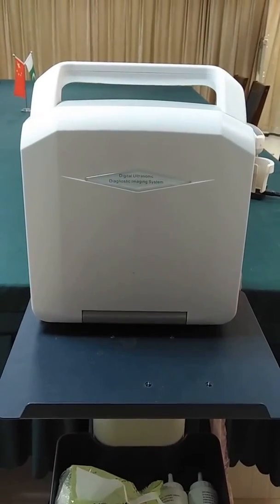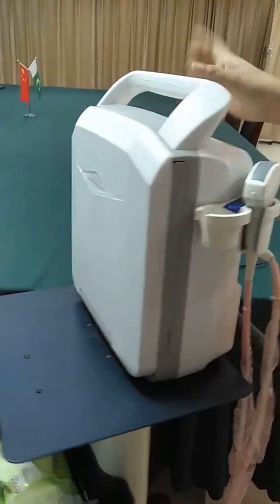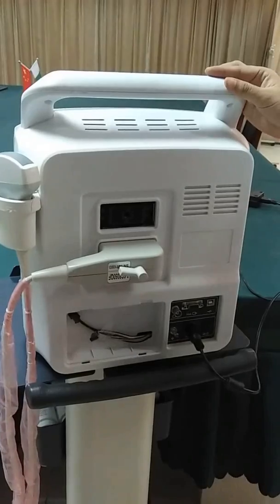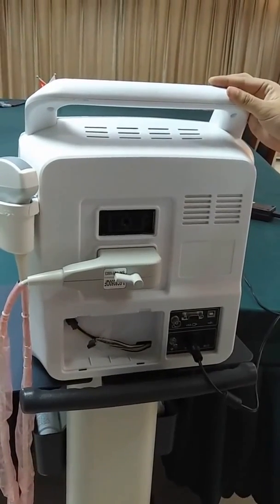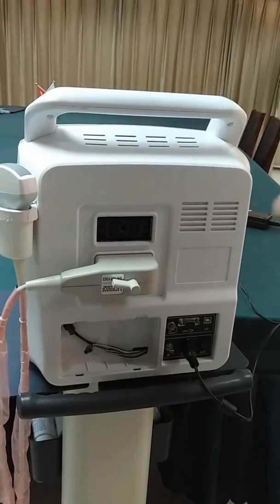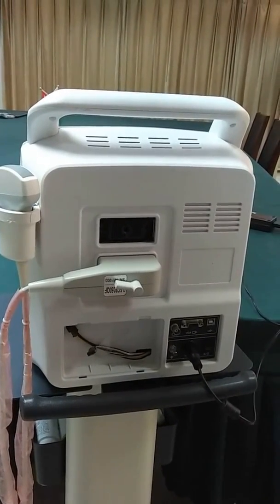It has a fashionable appearance with two handles here and two probe ports here. You can choose different probes according to your requirements, such as a convex probe, linear probe, transvaginal probe, and micro-convex probe.